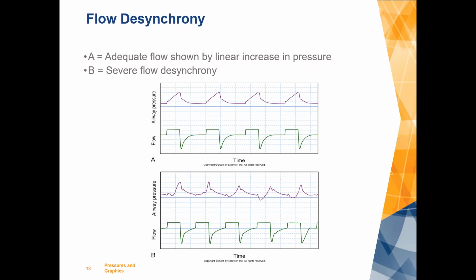I also do some work preparing new graduates to take the NBRC exams. It's going to sound a little bit lame, but when you're looking at an airway pressure or flow scalar and it looks notched out, and you're stressed out and don't know the answer, about half the time the NBRC is looking for you to increase the flow. That it's a flow starvation issue. I know that sounds a little bit lame, and we shouldn't be arbitrary in troubleshooting, but sometimes it's actually what it is, particularly if you're in a mode where it's not an I-time issue.